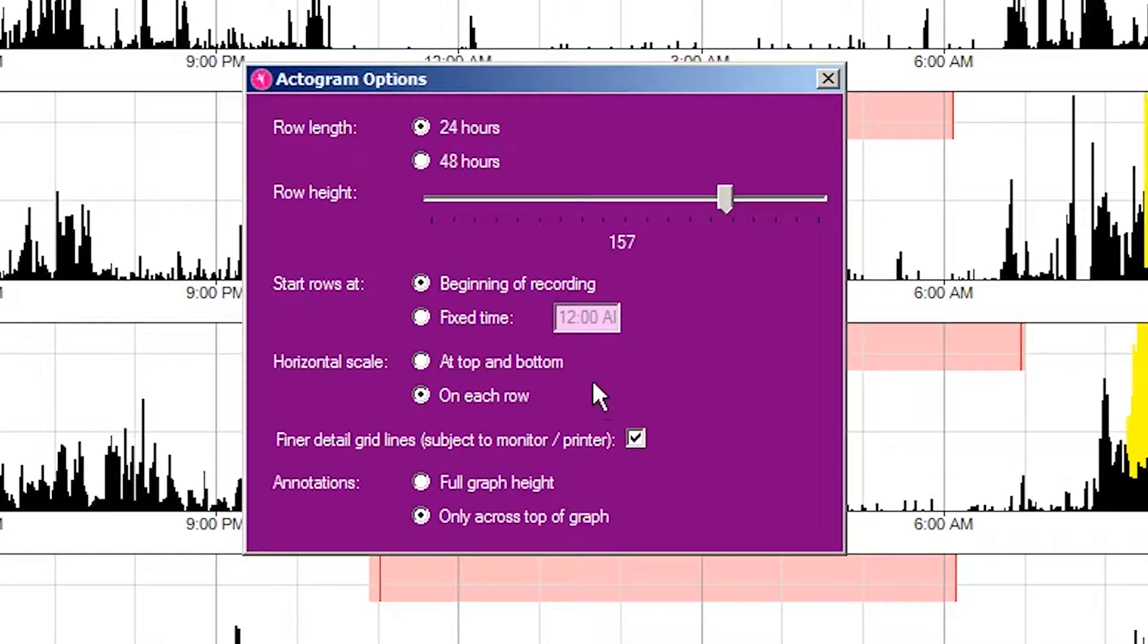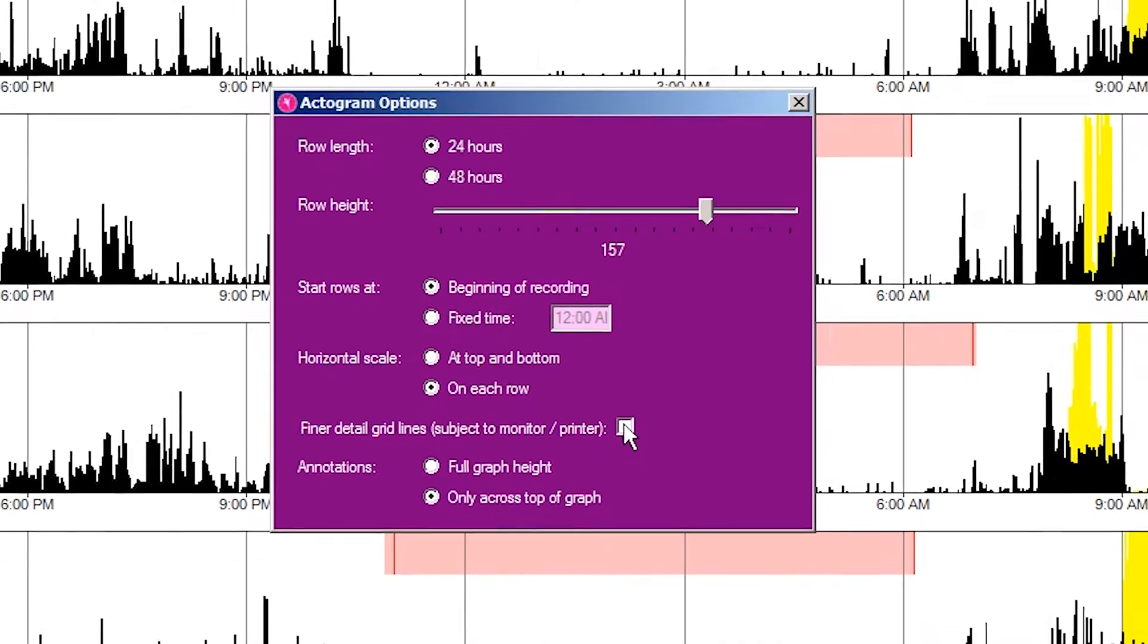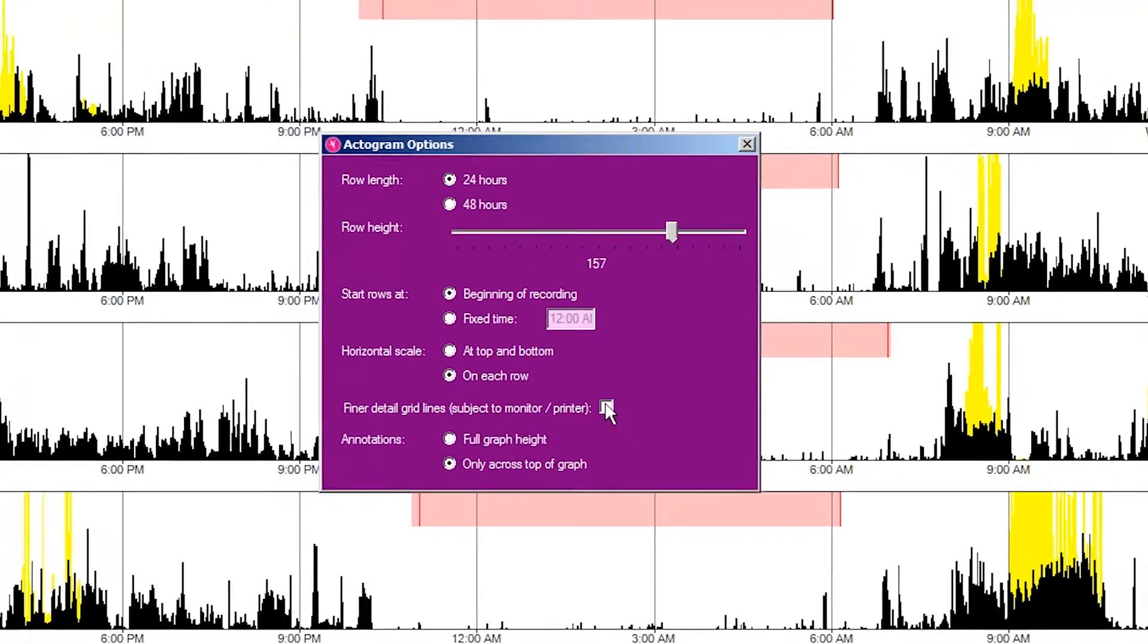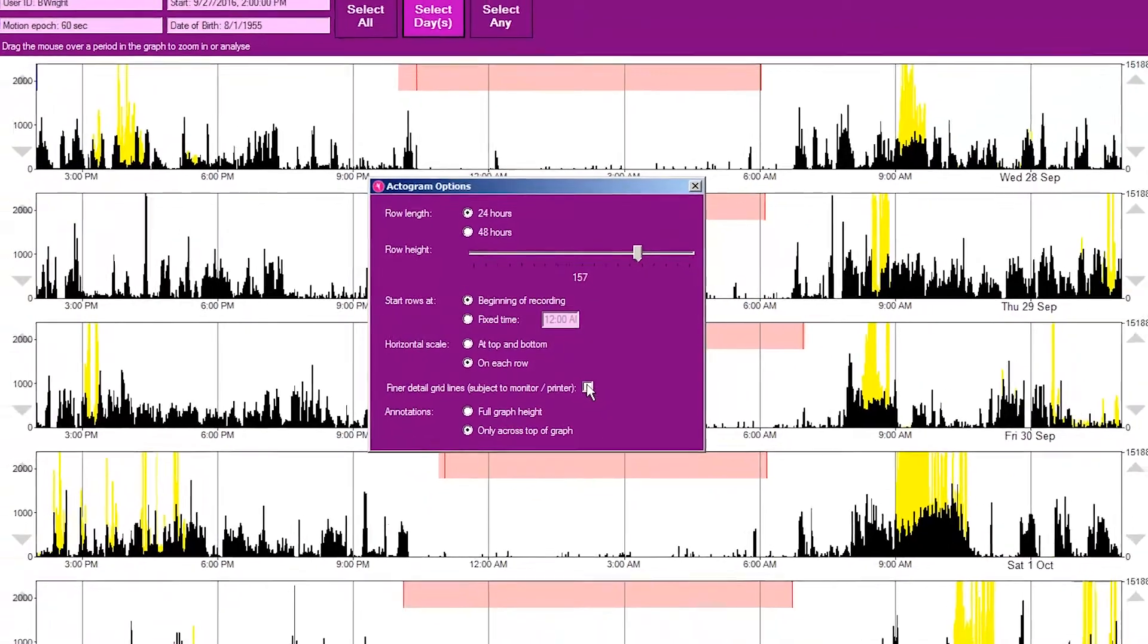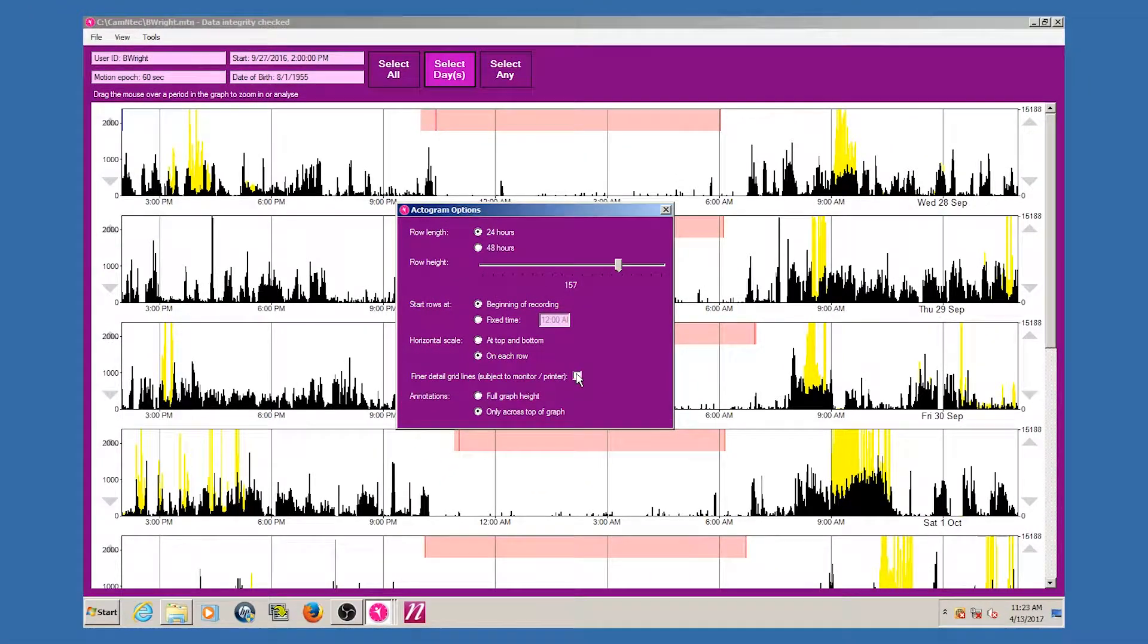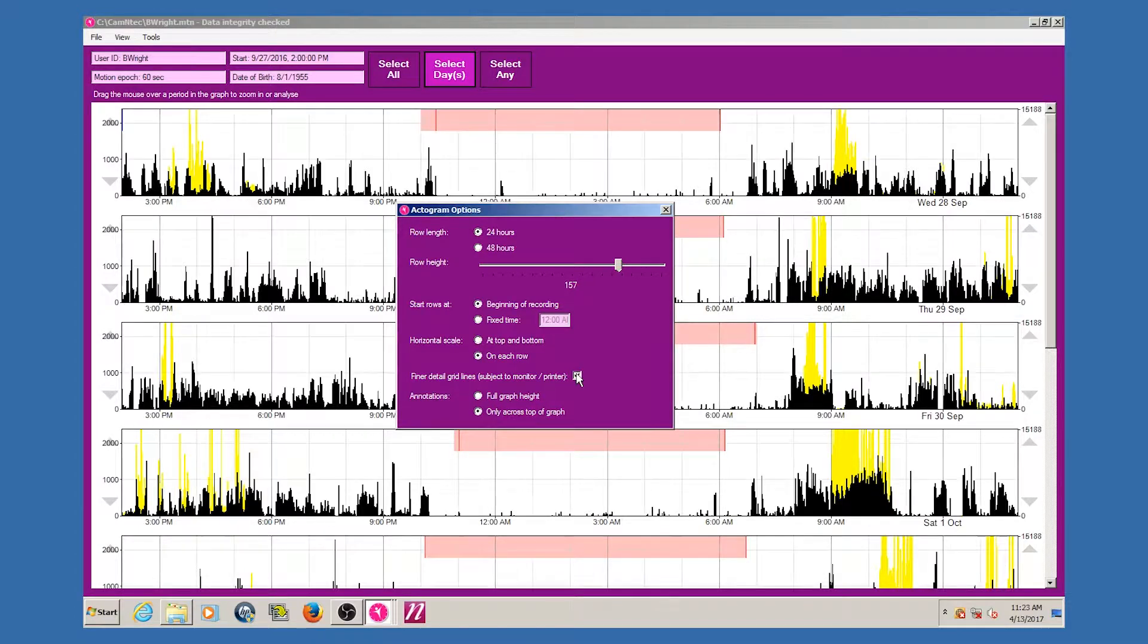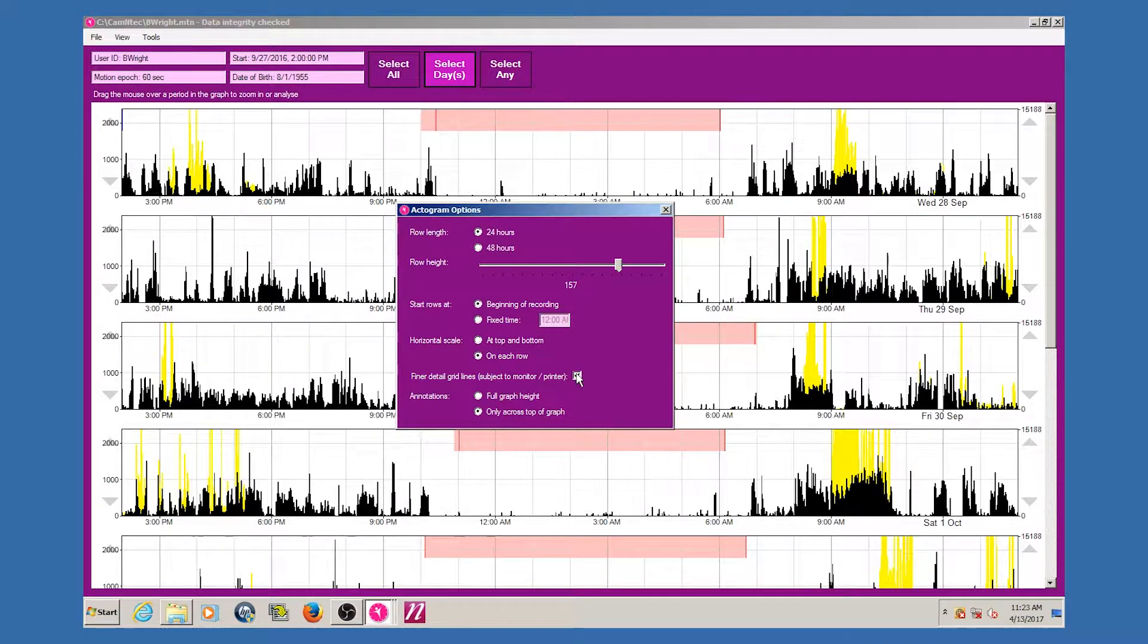The finer detail grid lines option allows you to show or hide the light gray hourly grid lines on the graphs. These will also depend upon the resolution of the monitor or the printer.